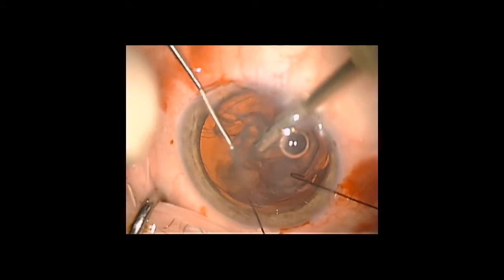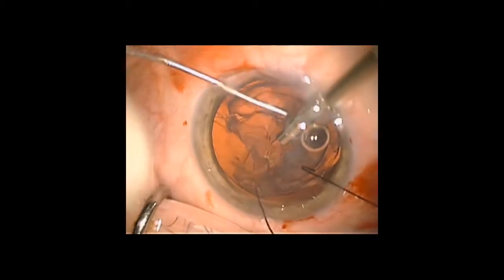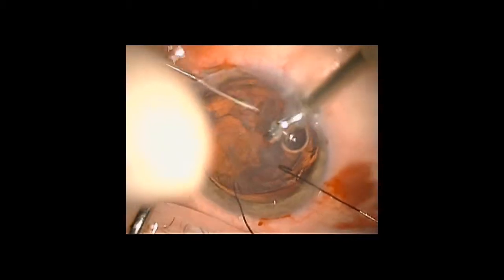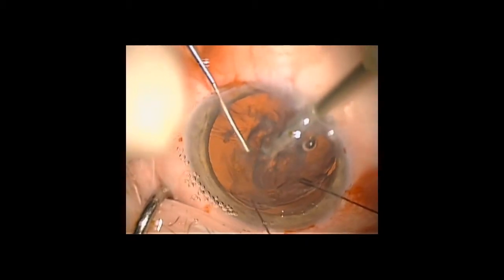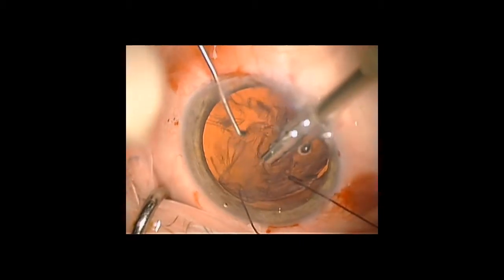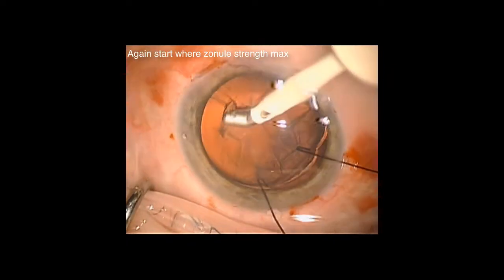Phacoemulsification is carried out gently, always utilizing the free hand with the chopper, in addition to simply chopping the soft nucleus, also to guide lens fragments towards the phacotip and away from the weak area of zonules.